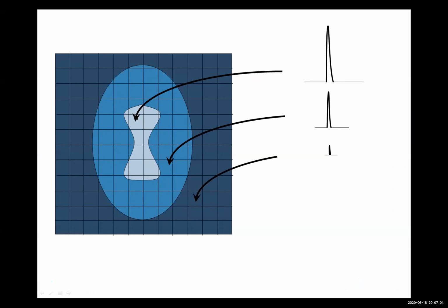As you can see, the signal is bright in the middle because it comes from an area in the brain which contains a high peak signal, and that is translated to bright compared to the area surrounding the brain, where there is no hydrogen and we expect to see no signal. The signal is very low or even noise, and that is represented by black. And in this image, really, there is something wrong, which I can see.